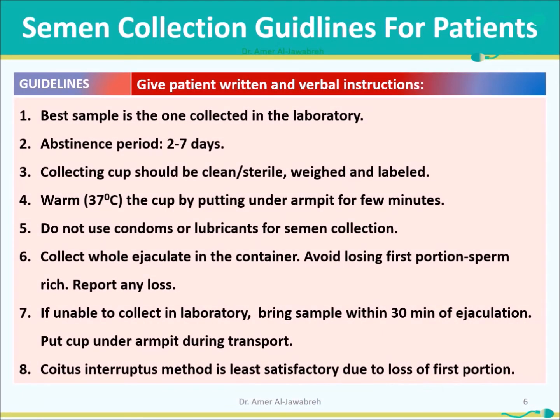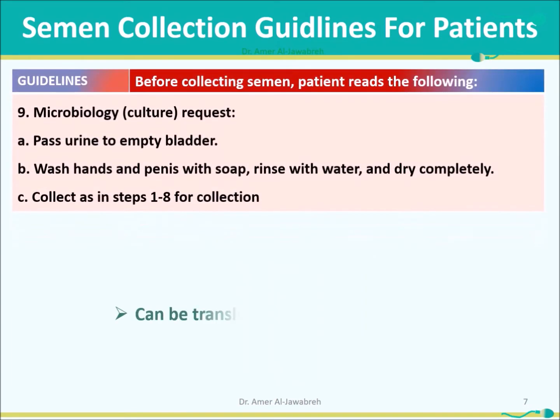Semen collection guidelines for patients. These guidelines should be given to the patient to read before collection, or read to the patient. They should be translated to the patient's language.